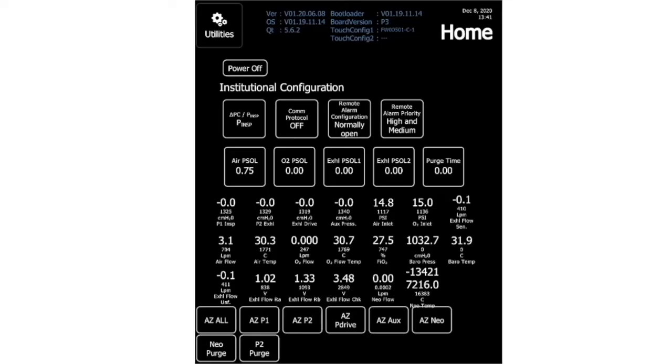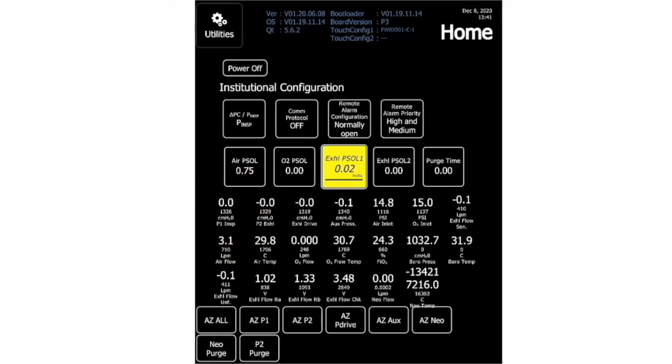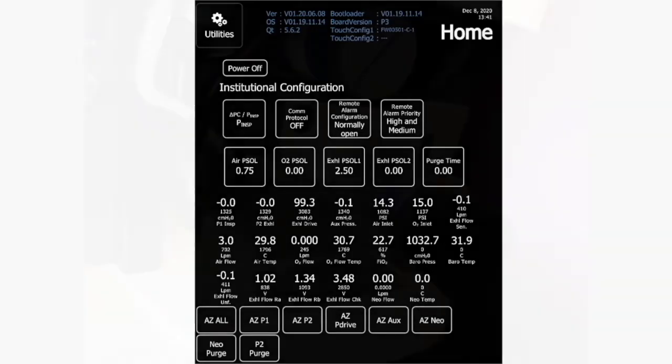Second, I want to select the exhalation PSOL number 1 button, and using the encoder knob again, I want to adjust it to 2.5 volts. This will totally occlude my expiratory side. With my expiratory side occluded, this should build up pressure on my P1 and P2 values. Notice both of them are 0, so I have a huge leak.